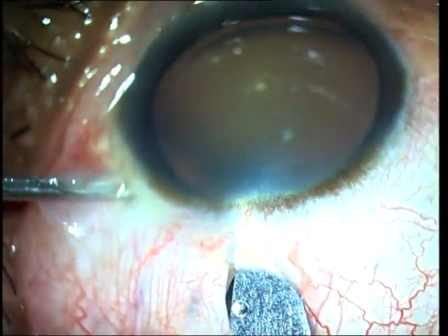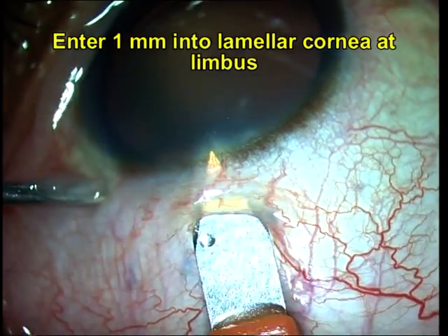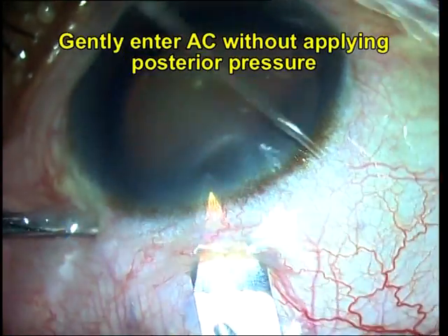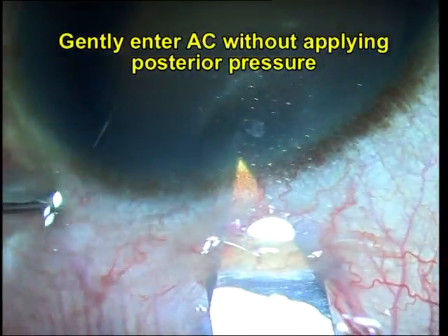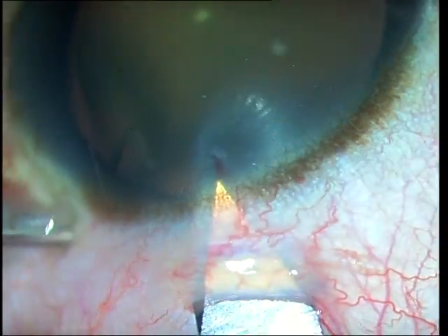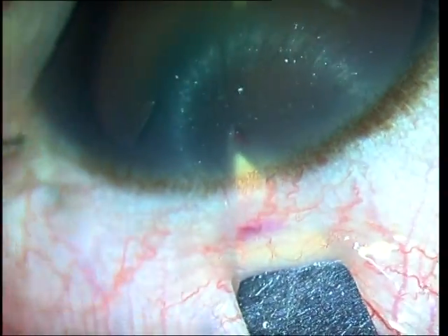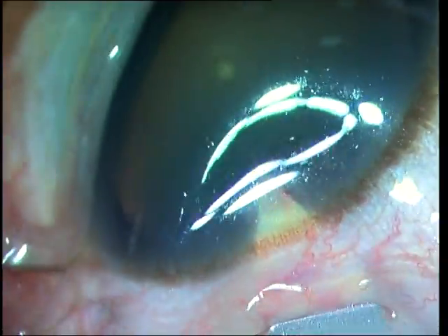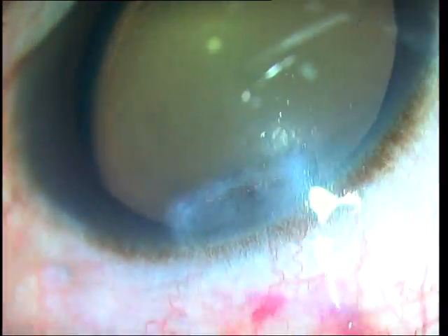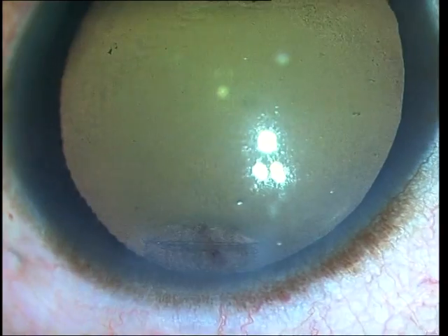Once I reach the limbus I go into lamellar cornea about 1 mm from the limbus, and at this point I turn my keratome horizontally and enter through the deep cornea into the anterior chamber. I allow the full horizontal extent of the keratome to enter so that I get a 2.8 mm wide internal entry for the tunnel. In this manner I have created an entire sclerocorneal tunnel with just one single movement of the keratome. You can see the internal lip of the corneal tunnel right there and the distance that it should be from the limbus.